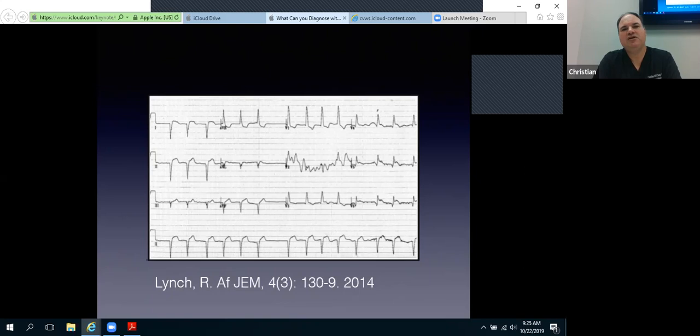So if you're going to treat somebody who has a STEMI in certain parts of Africa, you're not going to have a cath lab to send them to. And you're only going to have an expensive dose of thrombolytic agents to use, and not many of them. So the pressure's on to get it right. And so this is an EKG that they demonstrated where there was evidence of ST elevation in leads 1, 2, and slightly in lead 3 too. So the interpretation was an acute STEMI in the inferior and lateral leads. And you can see ST elevations in V5 and V6 as well there.